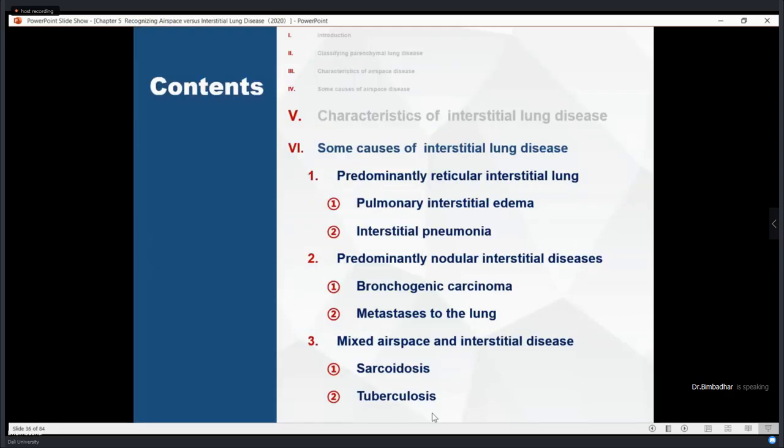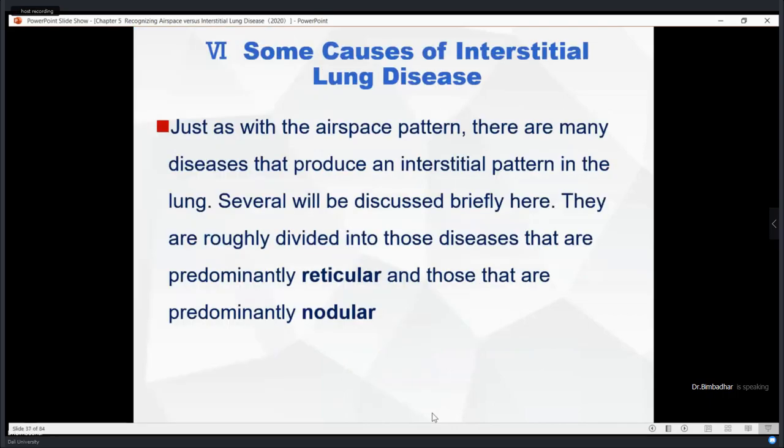Now we'll start looking at one of the most specific examples. We'll start with interstitial edema. Some of the most important causes of interstitial edema you have to remember, and look for the patterns of the mixture of all these opacities.